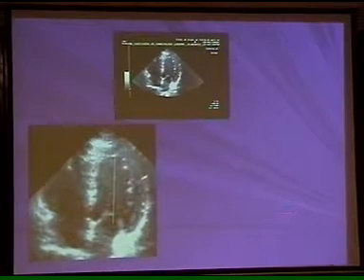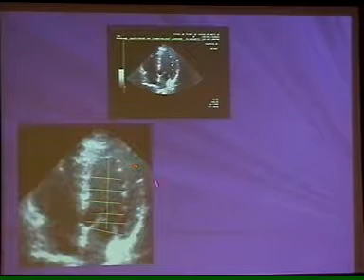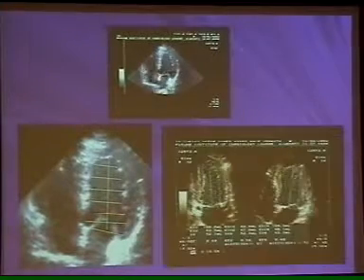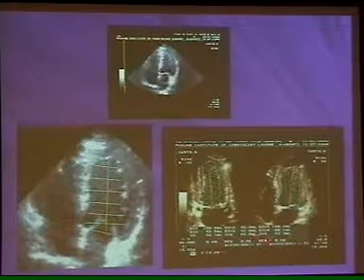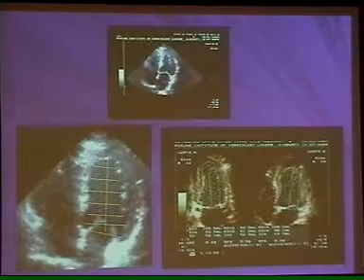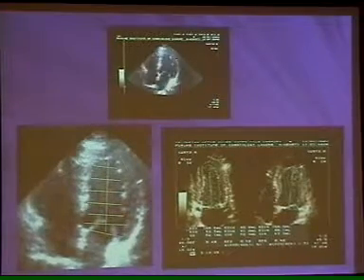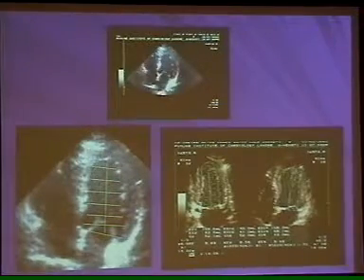The idea is you calculate the length and the computer gives a landmark, the computer calculates the area for you at different segments, summing up the area, and this is how ejection fraction is calculated. You can do it in 4-chamber, you can do it in 2-chamber, and that ejection fraction, mind you, is the accurate one. So this is the reliable method.